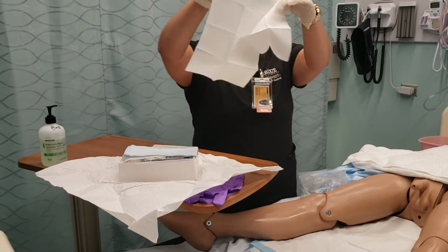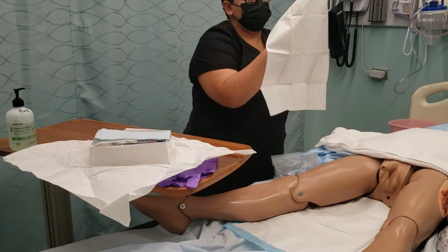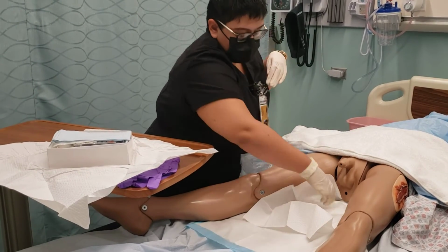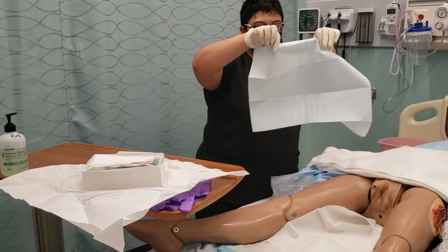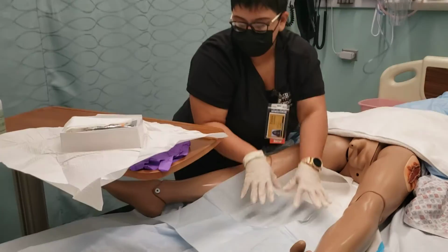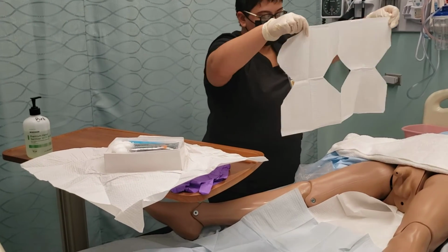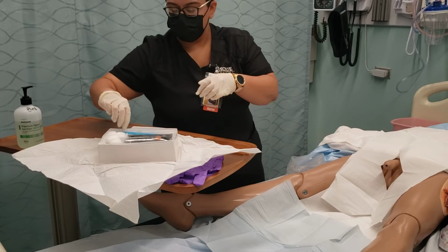I am going to change my gloves. And make sure that I keep my gloves sterile. Place that underneath my patient. I'm going to prepare my kit. And my bag is my little mini procedure. Okay. And then I'm going to drape this over my patient.